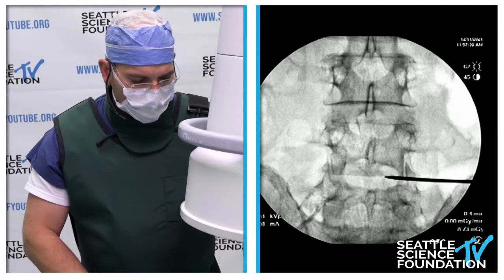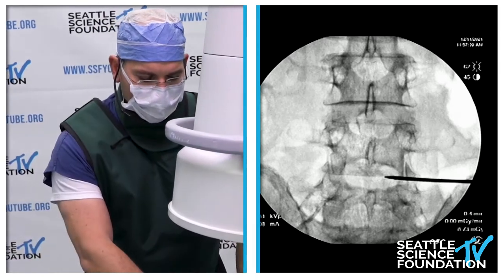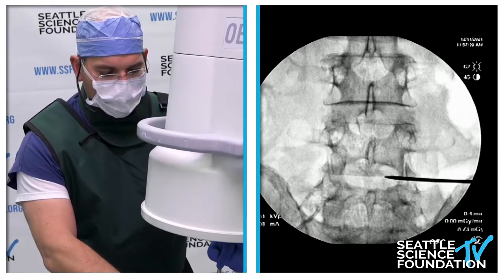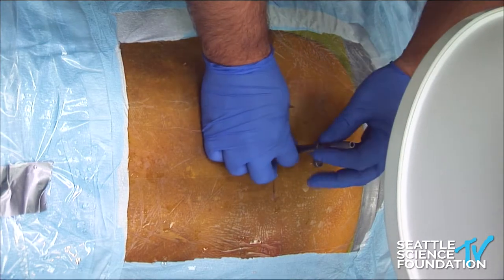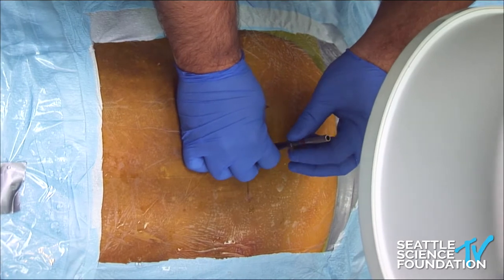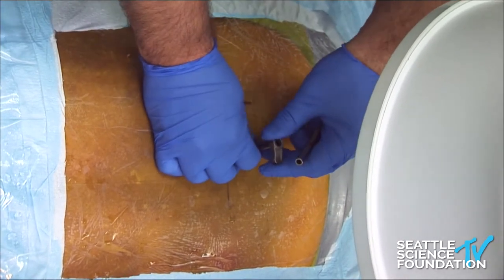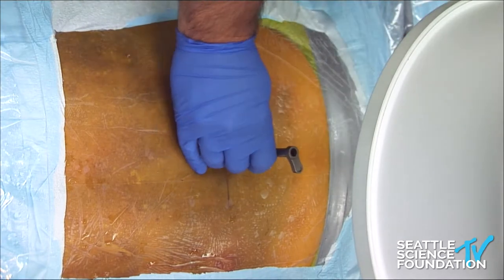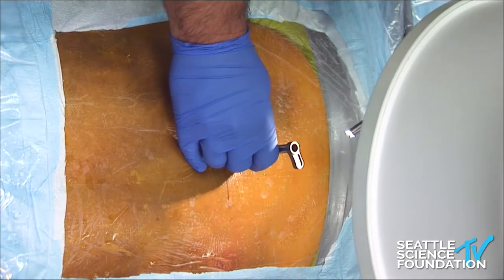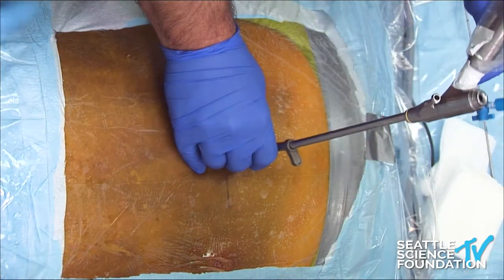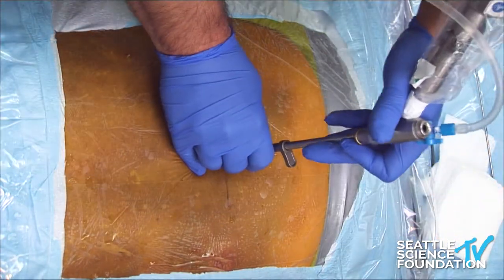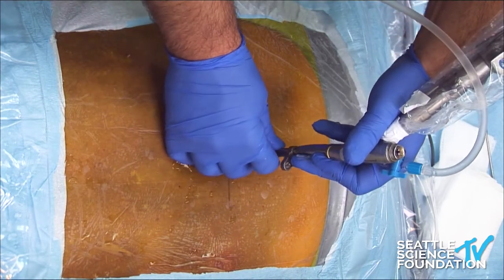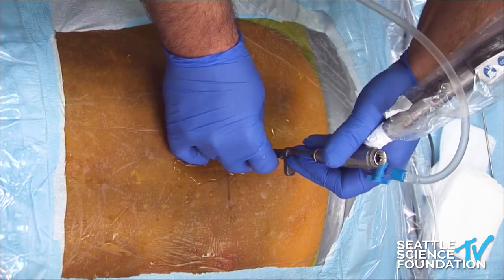We have the dilator — I already prepared that — and we put that in here. Get the tubular retractor in there. This is a tactile feedback part of the surgery; I can feel the bony edges. We come out with the C-arm and then we get into the endoscope. Everything is prepared. You can see the lamina of L4, which I drilled already.